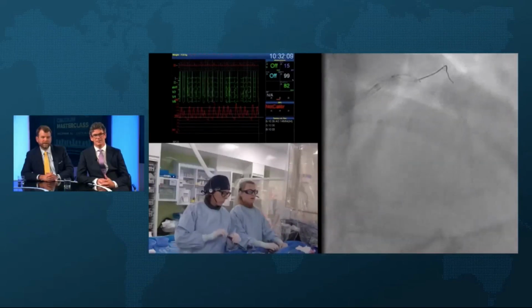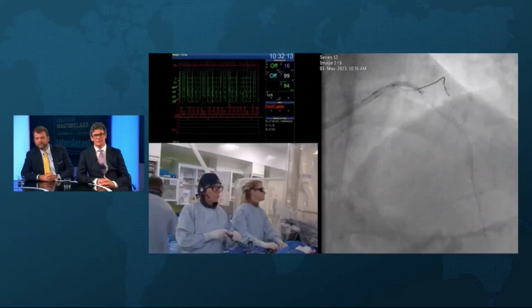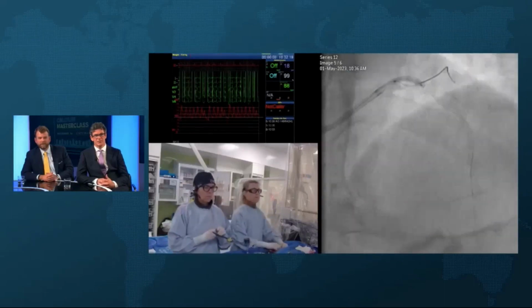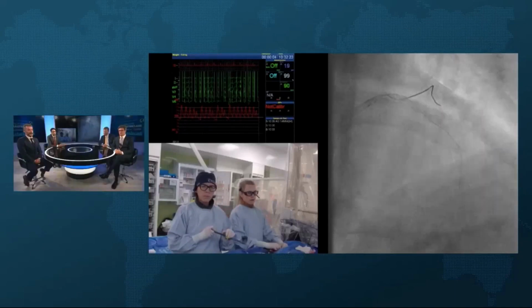And I guess the other thing about the setup that we didn't mention is you've got the Rampart radiation protection in place as well, which is great for the team to be able to work in essentially a radiation-free environment. Margaret, you're pretty much used to that in the US already now, aren't you?